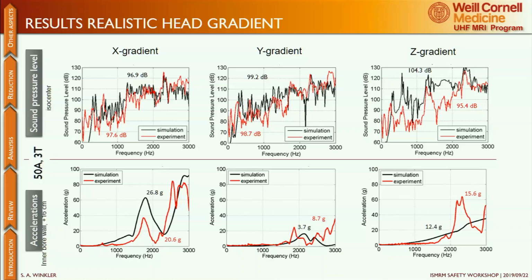We think that these new tools can now offer a lot of ways to reduce sound pressure levels. And I think, in addition, we can also look at gradient cooling, which is important for safety. So thank you for listening.